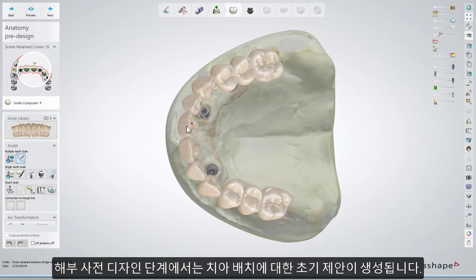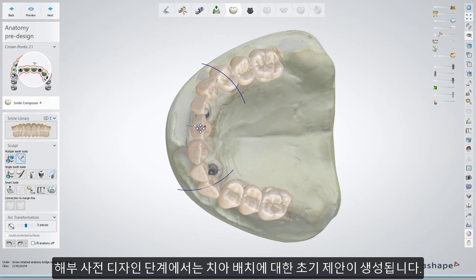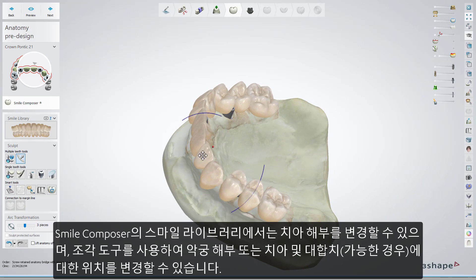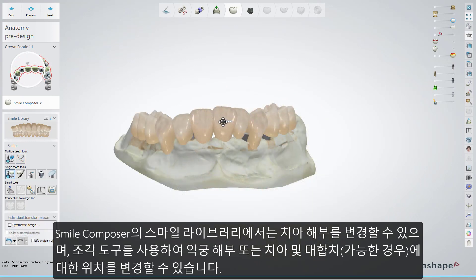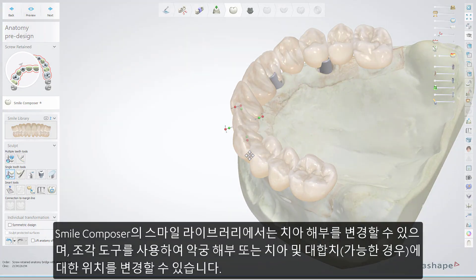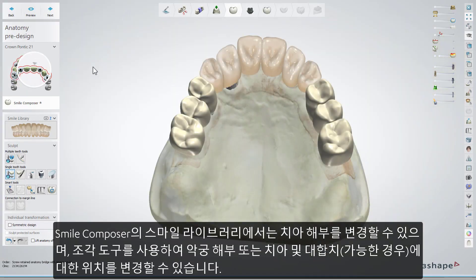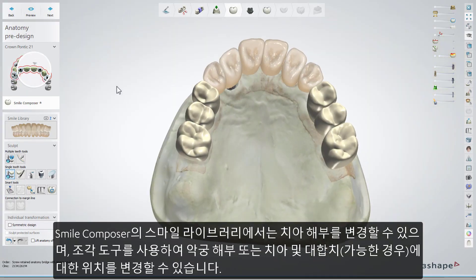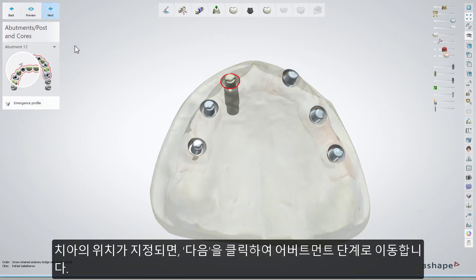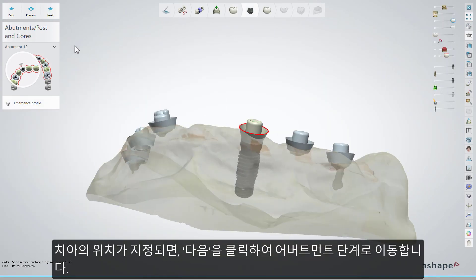In the anatomy pre-design step, the software will generate an initial suggestion for teeth placement. The Smile Composer's Smile Library allows you to change the teeth anatomy, and the Sculpt tools give you the possibility to change the placement in relation to the jaw anatomy, other teeth in the arch, and antagonists if available. Having the teeth positioned, click Next to move to the abutments step.